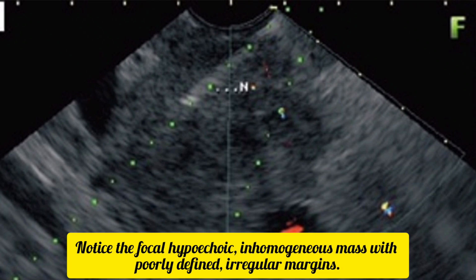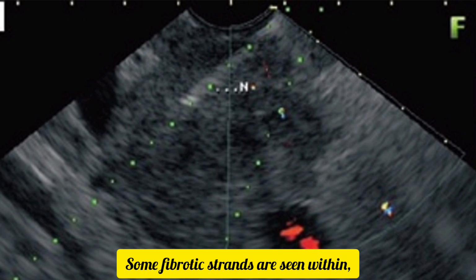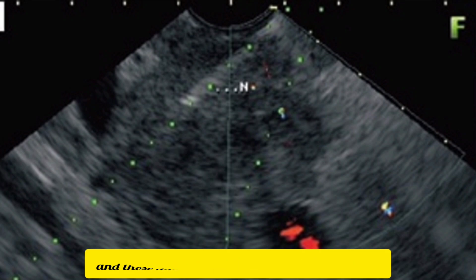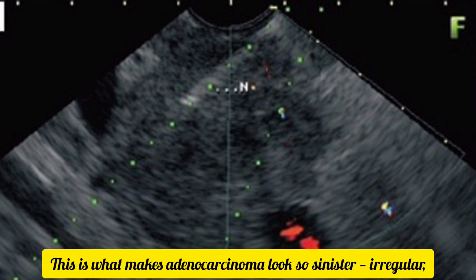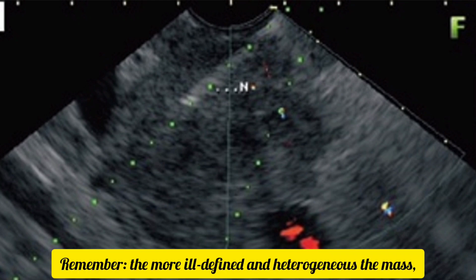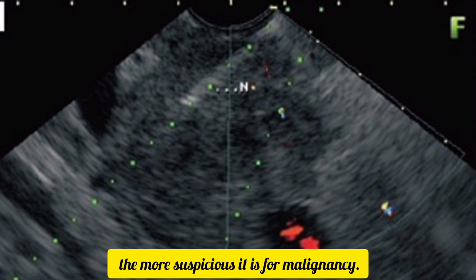Notice the focal hypoechoic, inhomogeneous mass with poorly defined, irregular margins. Some fibrotic strands are seen within. And those dark, anechoic areas, that's necrosis. This is what makes adenocarcinoma look so sinister: irregular, infiltrative, and destructive. Remember, the more ill-defined and heterogeneous the mass, the more suspicious it is for malignancy.